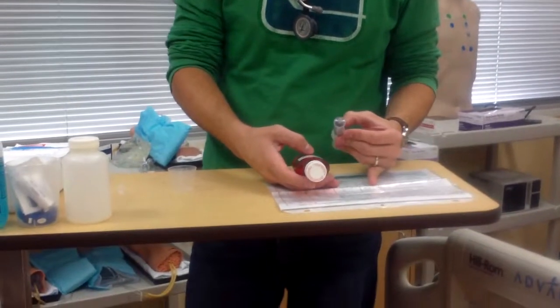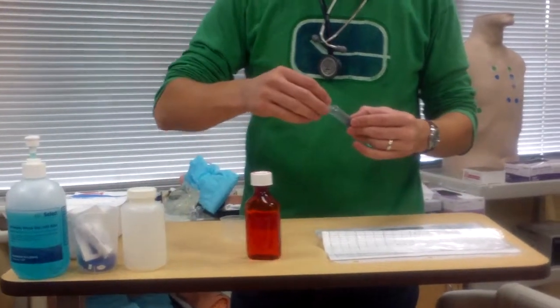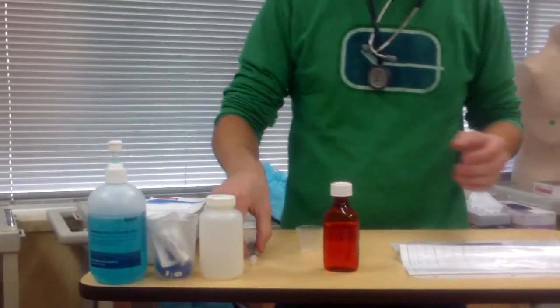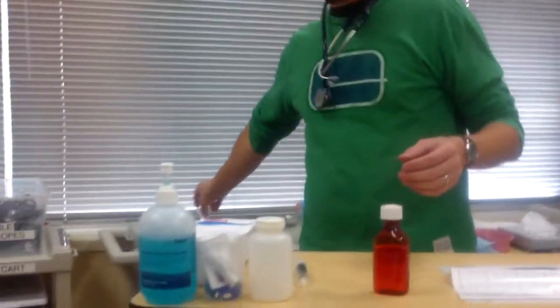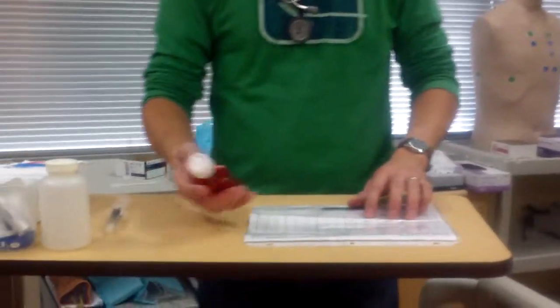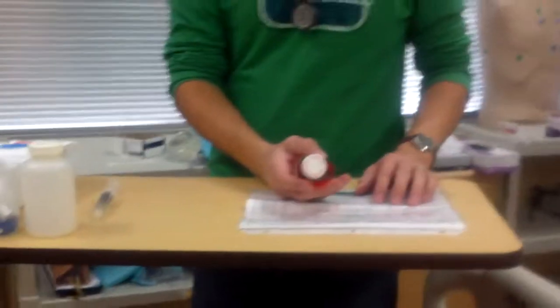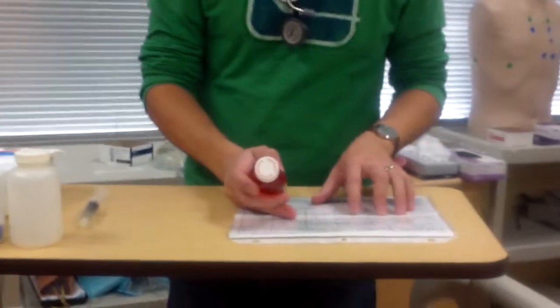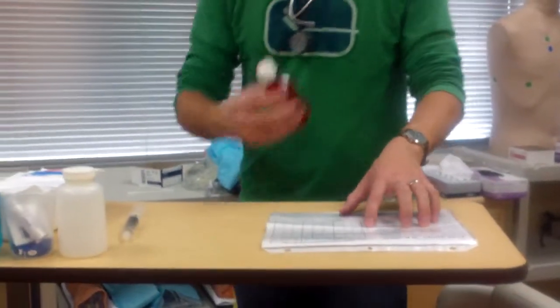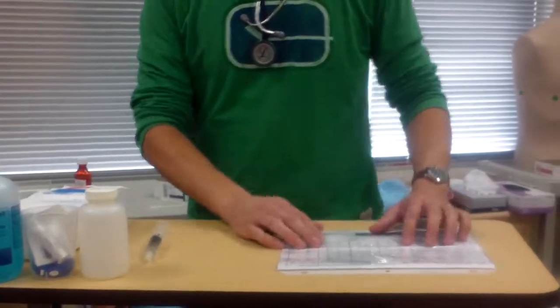10 milliliters is my second check. I think it's good. I got the right medication. All looks good. I'm going to set that aside. It's going to go in the garbage. And then my third check, as I'm putting it away, I did get the right medication for Jane Jones here. Time, route, dose, medication still. That all adds up. So I'm going to be putting this away. So that's put away. Lock up my med cart.